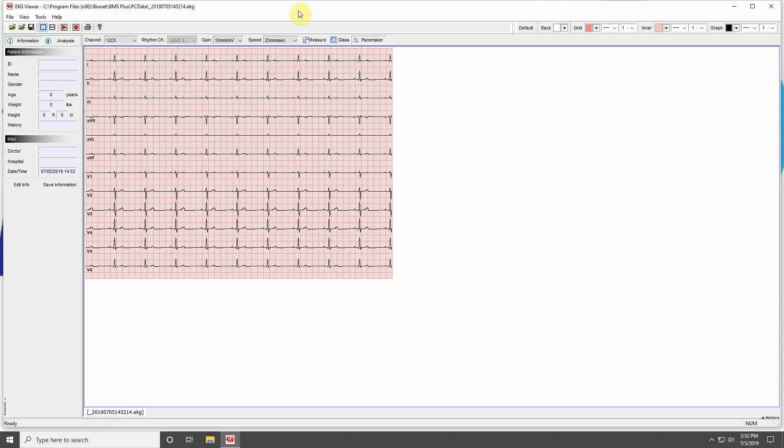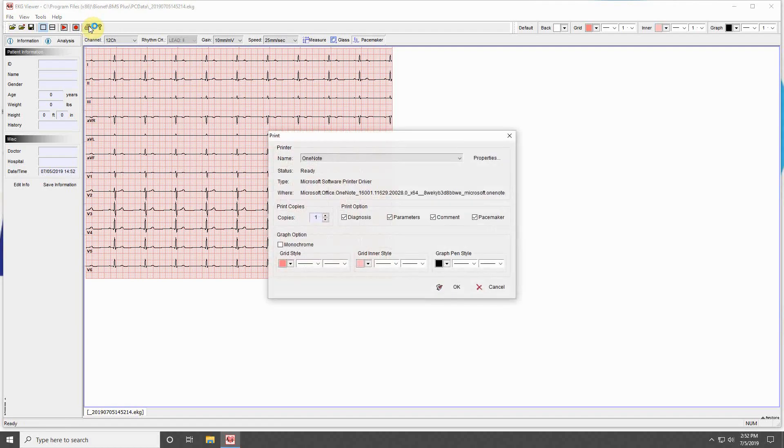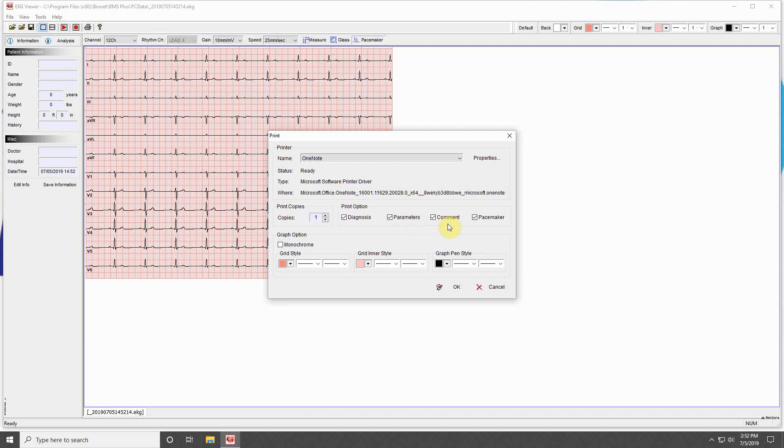The last buttons allow you to print the current ECG selection and view the software version. When printing, you can select how you would like your printout to look. These options allow you to choose what information is on your printout, including the program diagnosis, the numerical values of measured parameters, any comments made to the file, and if pacemaker indicators are printed.